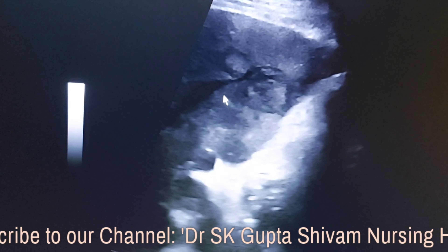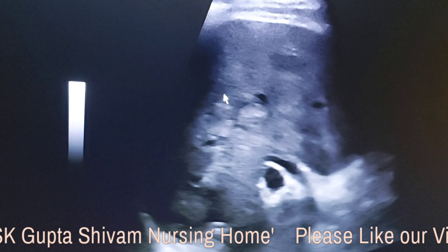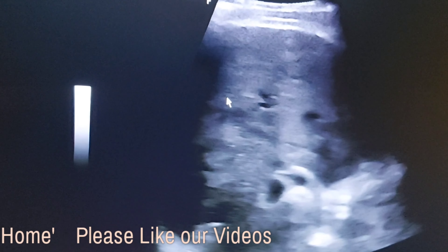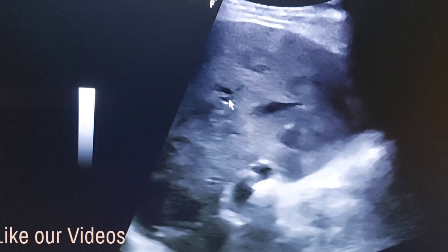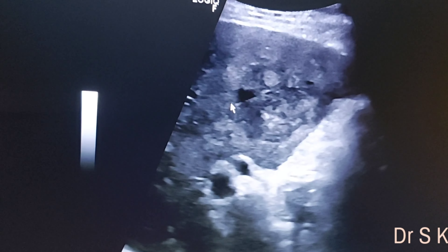The secondaries in the liver can come from colorectal tissue, from the intestine, from the breast, or from the lung. Let us try to find out whether we are having secondaries from any of these organs.